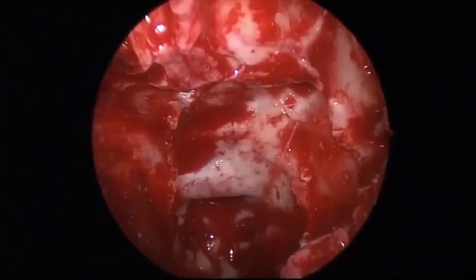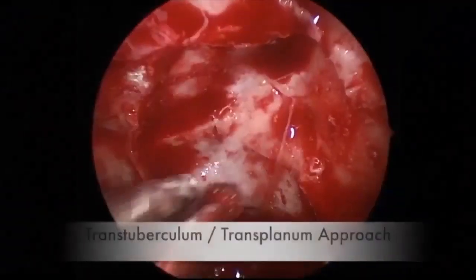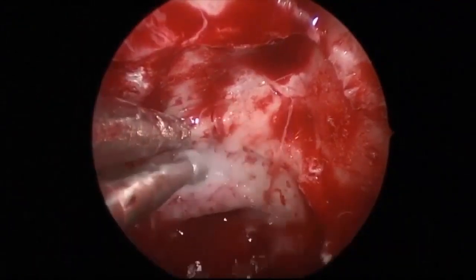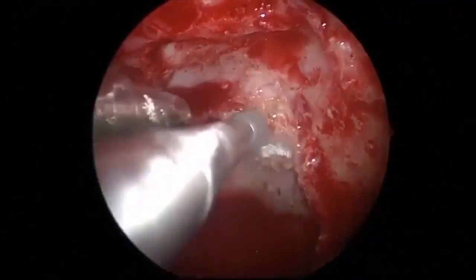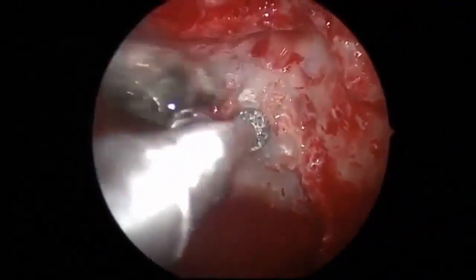The posterior ethmoids have to be removed. Here you can see the tuberculum sellae, the planum, the left and right optic canals, bilateral medial OCRs, and carotid prominences on each side. We begin the transtuberculum approach by removing the tuberculum at the top of the sella. This is done from medial OCR to medial OCR and extending up into the planum.